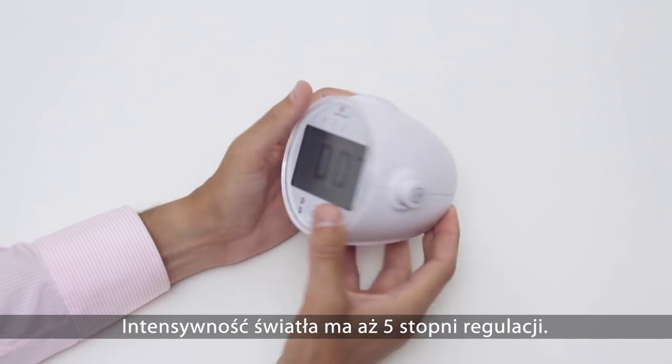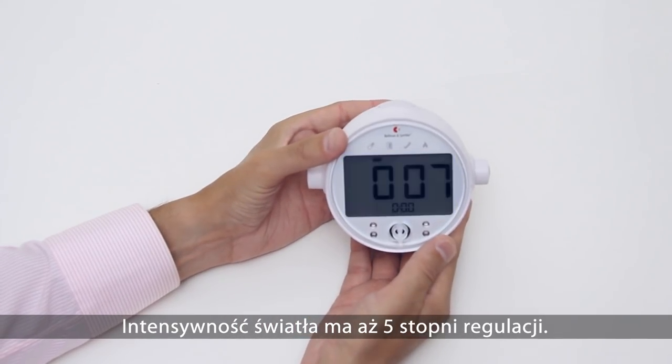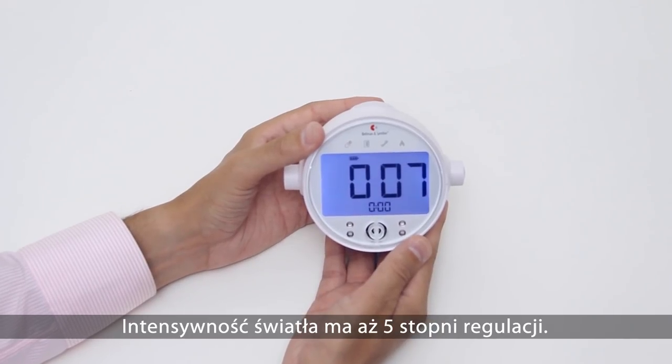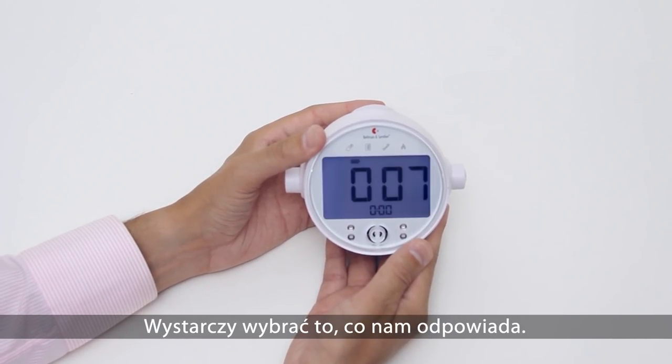The backlight intensity can be set in five steps, from completely off to a quite bright level. Just choose the one you like.